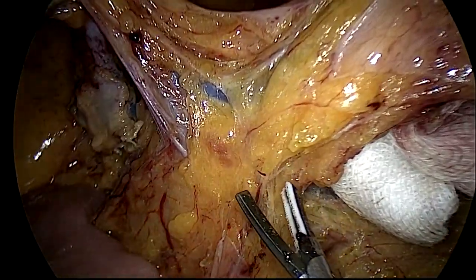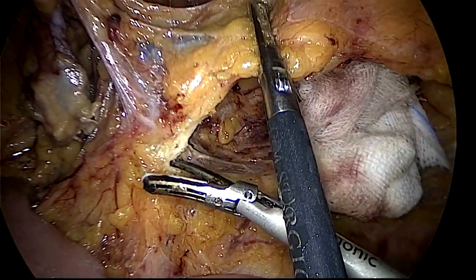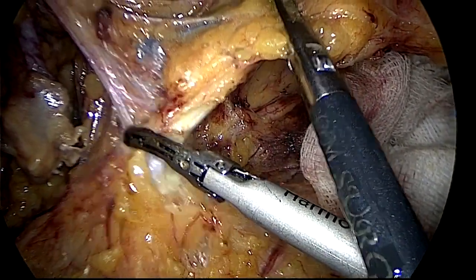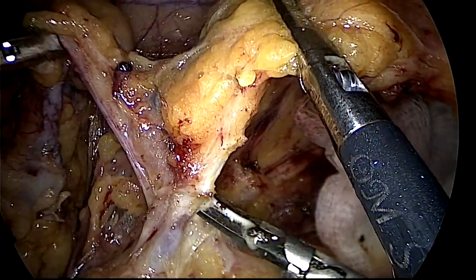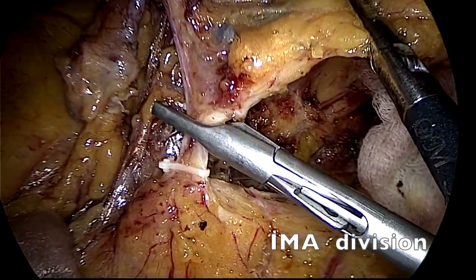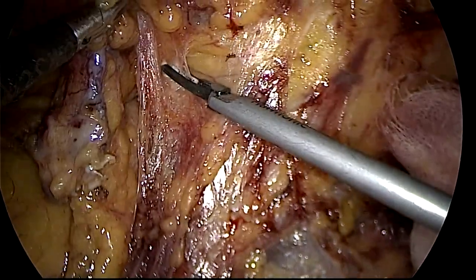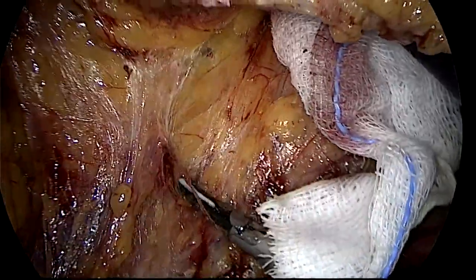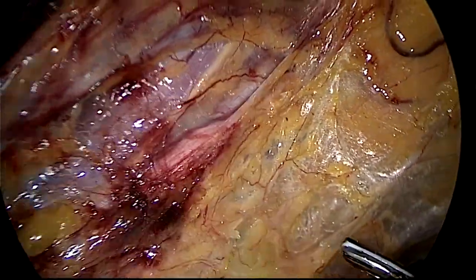The endpoint of the dissection is visualization of the colon. All the fibro-fatty and lymphatic tissue is cleared along the root of the IMA, which is being dissected and divided. Please notice that the IMV and left colic artery are held up by the assistant in a seagull or batwing maneuver. Following the division, a correct plane must be identified which is higher up and all red tissues should be dissected down. The iliac vessels and the left ureter can be seen dissected down over there.